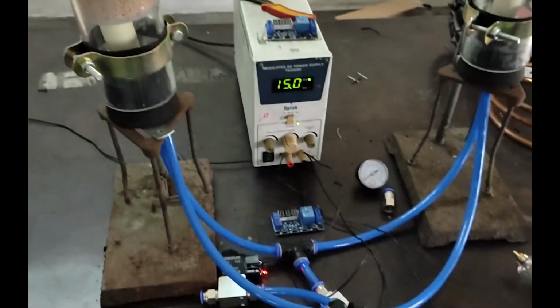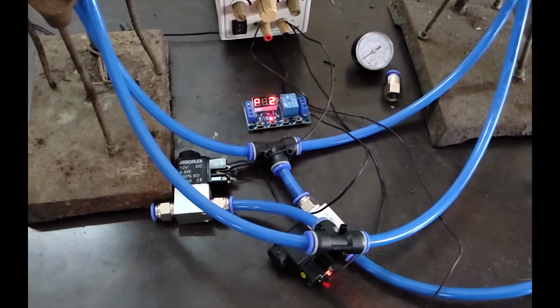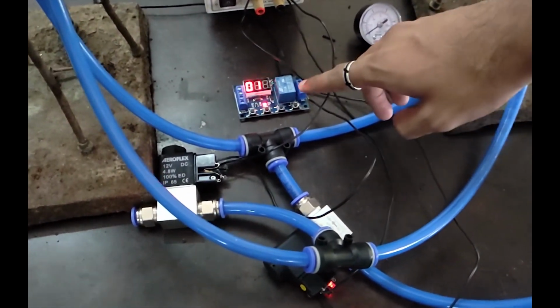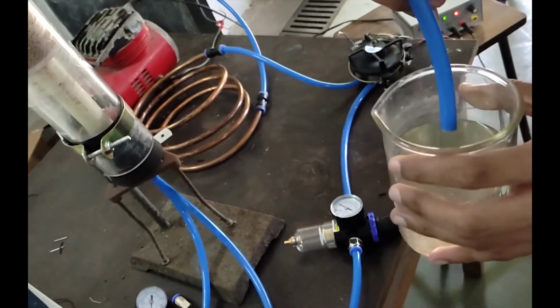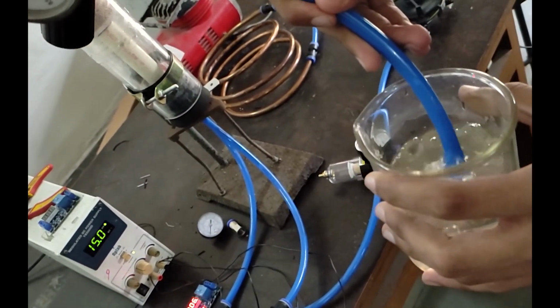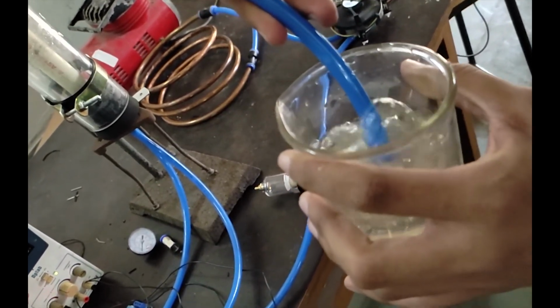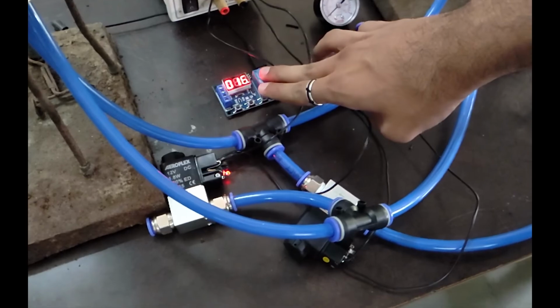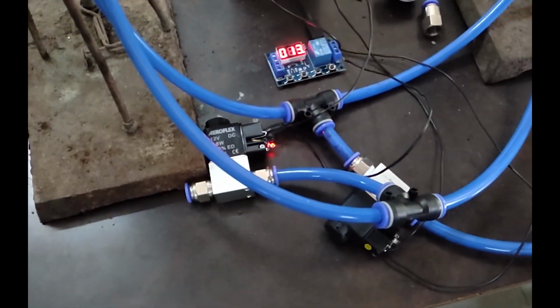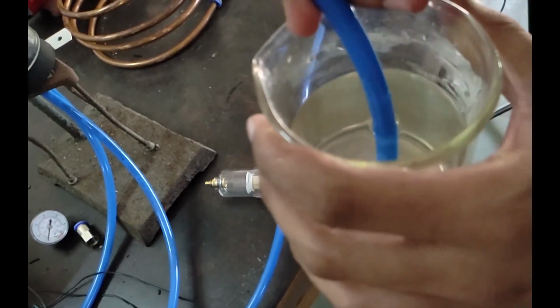Now let us see how the system works by turning it on. Now you can see that at the initial stage a cycle of 20 seconds is present, and the air is getting supplied to the column, and we can see that the output is coming as the air is getting vented. And after that, for 20 seconds the air is getting vented, and we can see that there is no air supply or no oxygen at the output side.